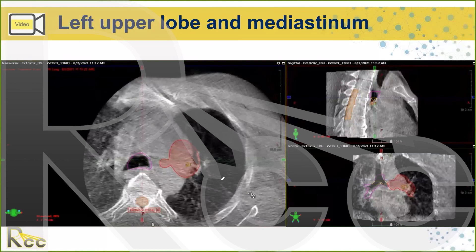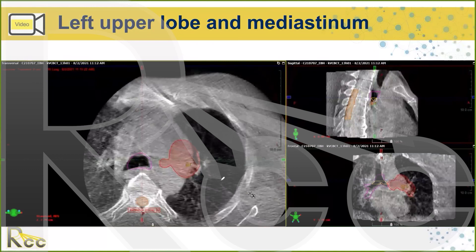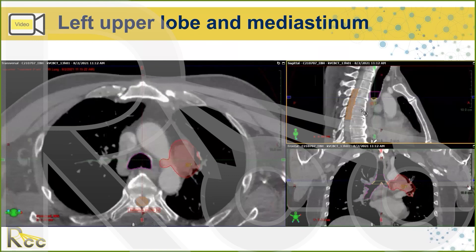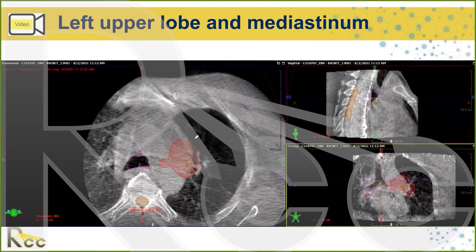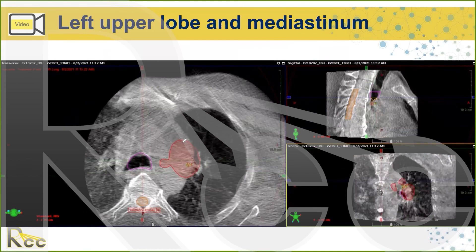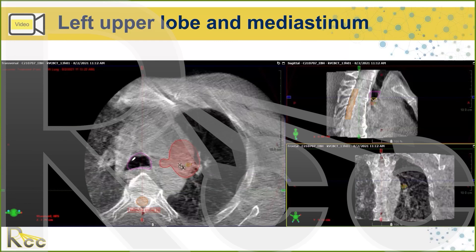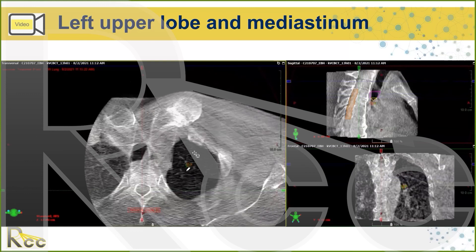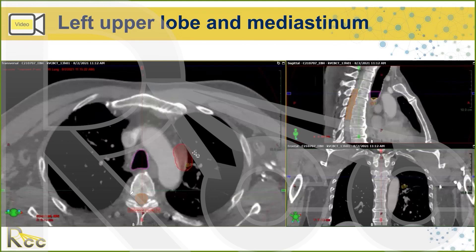You can see she's toggling rapidly between the cone beam and the planning CT. You can do that by flipping a toggle in Varian, or by pressing Control-A. Along with tools like the spyglass, Control-A is very useful. As she presses Control-A, the contours of the carina and the target stay fixed — you don't see them in certain views because they're not contoured there. That's an important concept worth rewinding to understand.